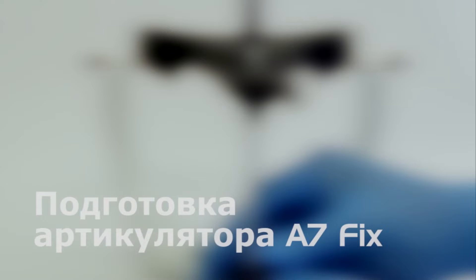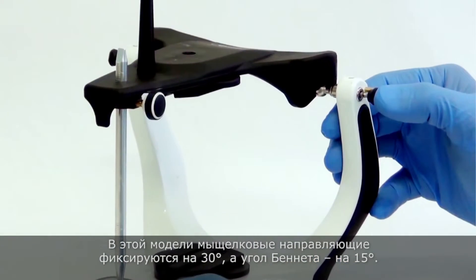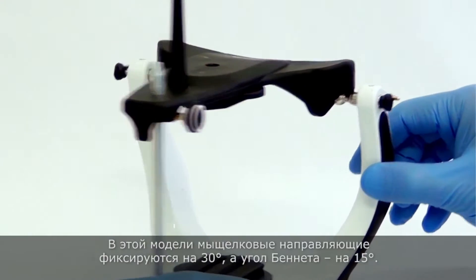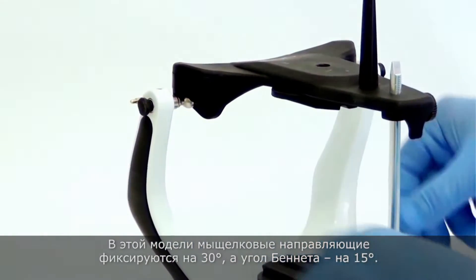Preparation of the A7 Fix Articulator. Push the locks into clamp and align the articulator's frames. In this model, the condylar guides are fixed at 30 degrees and Bennett at 15.